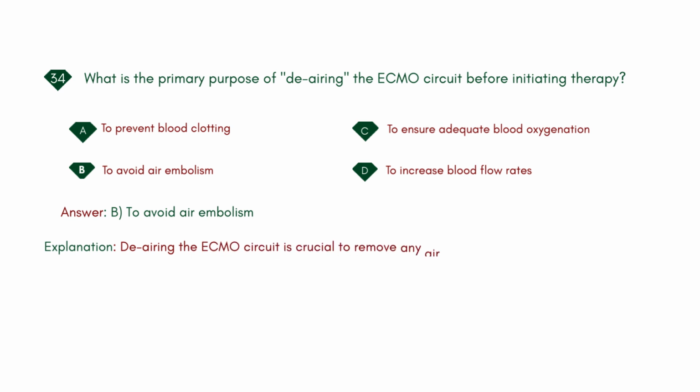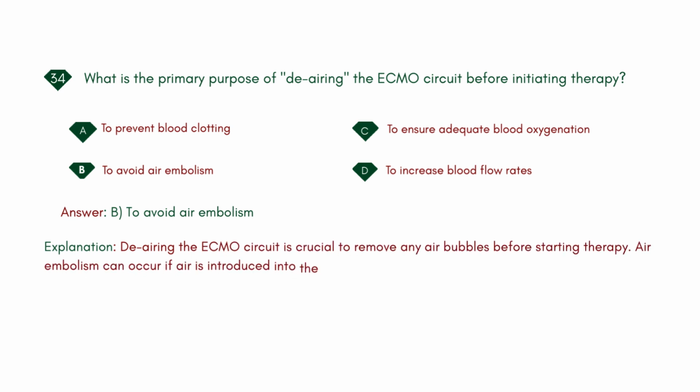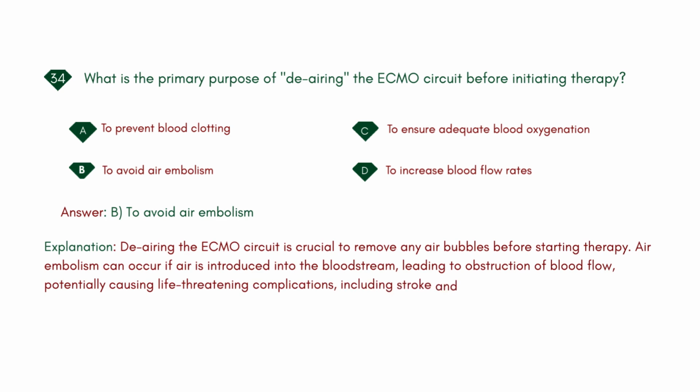Explanation: de-airing the ECMO circuit is crucial to remove any air bubbles before starting therapy. Air embolism can occur if air is introduced into the bloodstream, leading to obstruction of blood flow, potentially causing life-threatening complications, including stroke and organ damage.